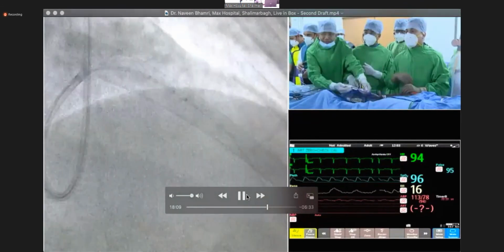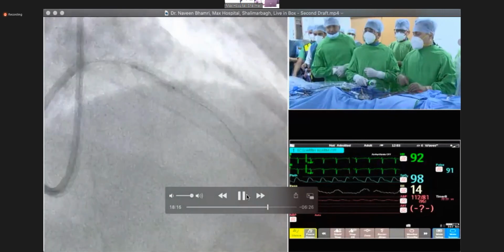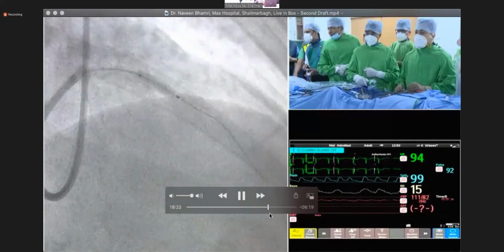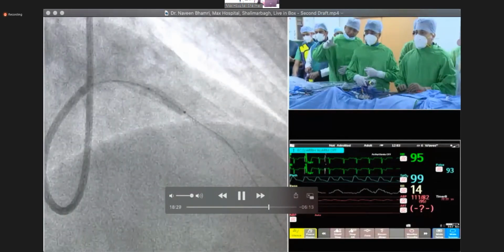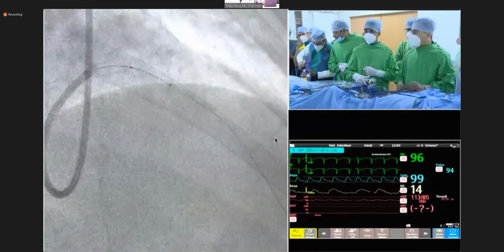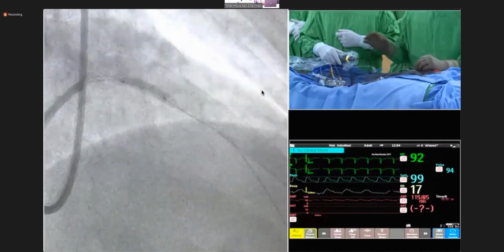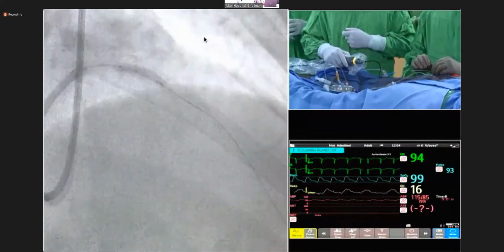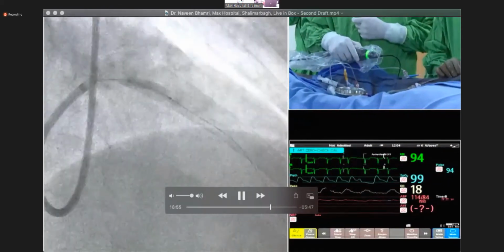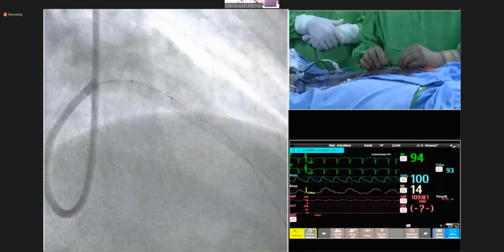We'll just check the position of this balloon. Ready? Stop that. Ready, start. So here we are going to deliver two 10-pulse cycles after an interval. Done. Store this. And again, we'll take it a little bit proximally. And here we have to give the maximum. Start. Inflated to 4. Again, inflated to 6. This time we will go a little bit higher, up to 6 atmosphere. Start pulses. Done. Now we will come out. I think I'll just check the balloon movement.